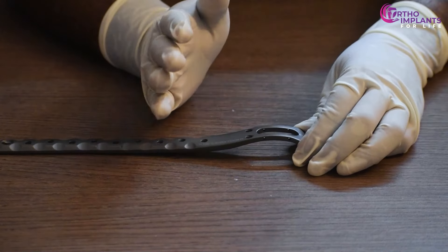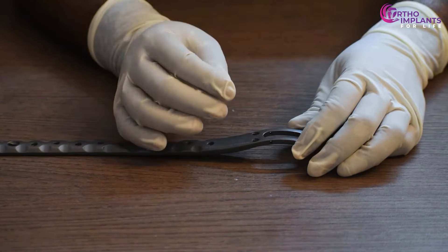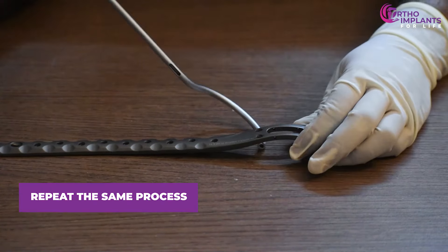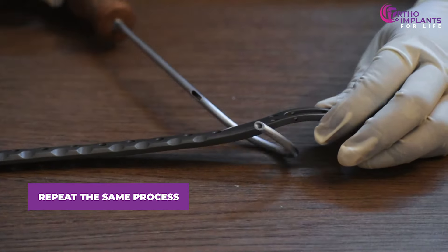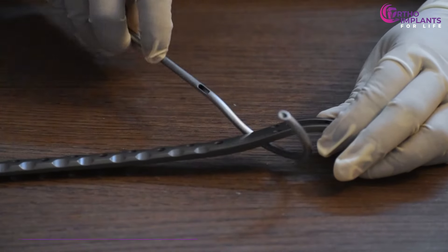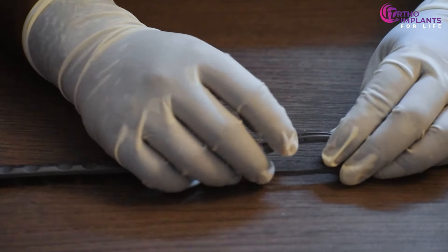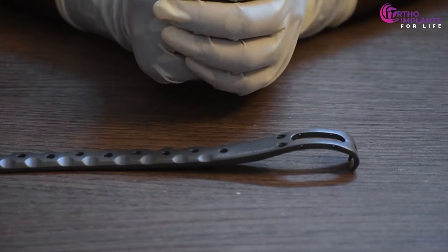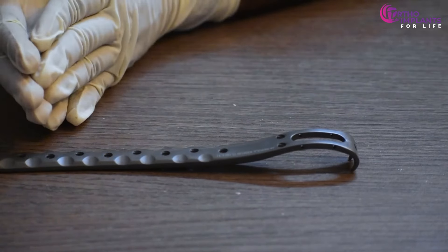We will keep the cable as it is, as we will apply compression later. It's better to apply compression for the entire plate together. Once done, we will repeat the same process through the second hole. We insert the wire through this hole, it comes out from the other end, then we remove the cable guide, pass it through the second hole and lock the cable with the plate. That ends the cable fixation of the proximal part of the plate.